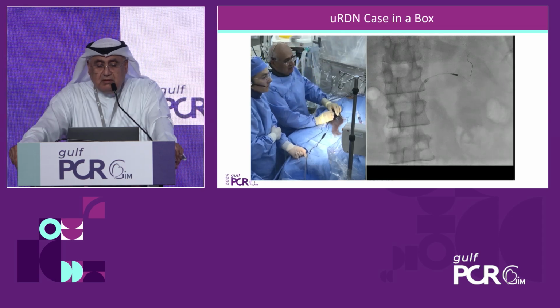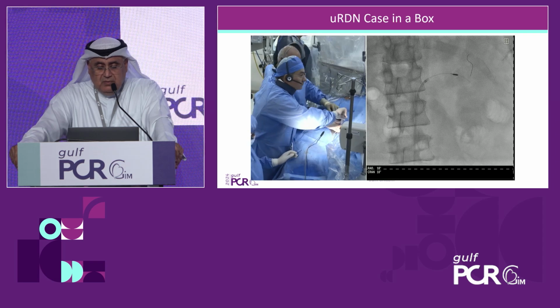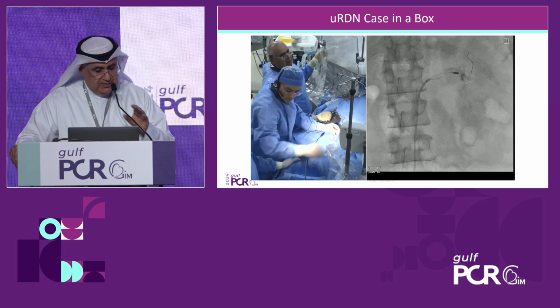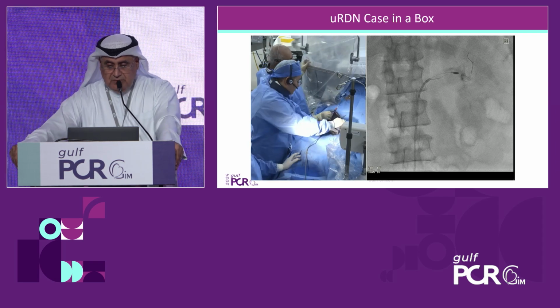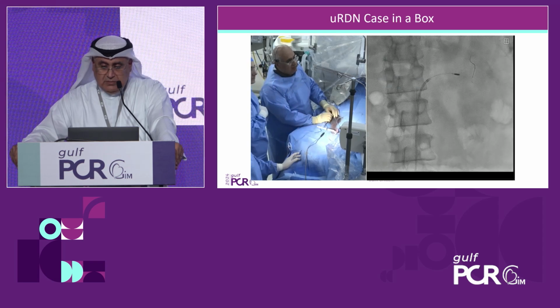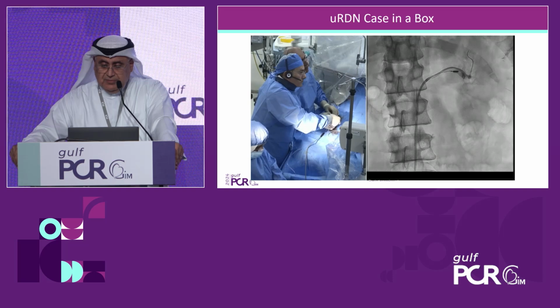Here we use, by the way, a run-through wire. So we give some nitro actually. And then we do selective, diluting the contrast 50% to 1:1 ratio to reduce the impact of contrast as much as possible. In certain cases, we use also RenalGuard to reduce the impact on the kidney function.